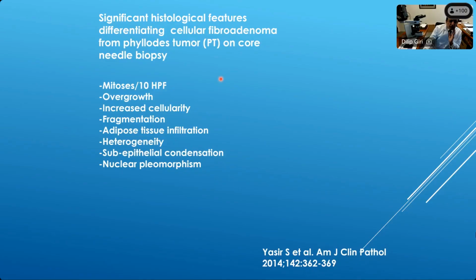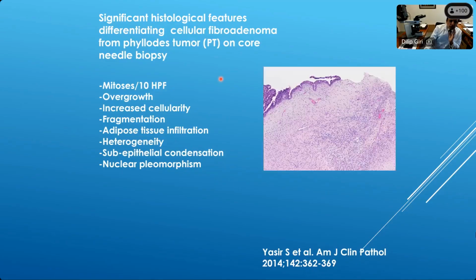And what the authors, so this is just to show you some of those features, like a cellular kind of stroma, increased cellularity.